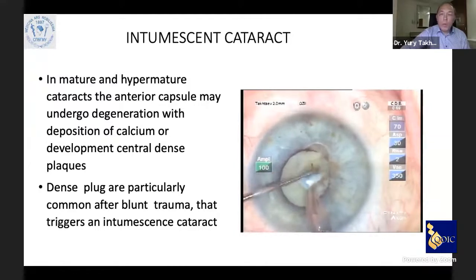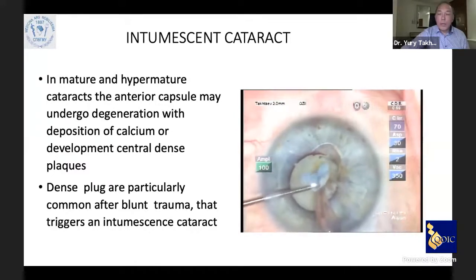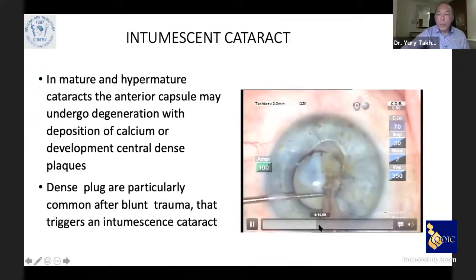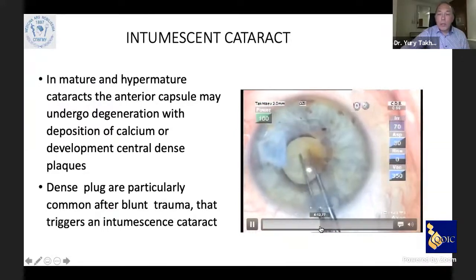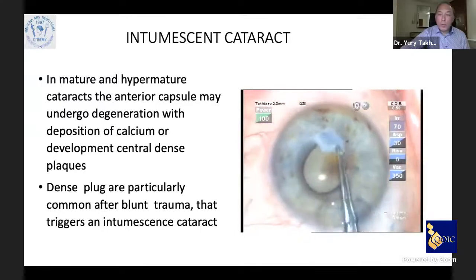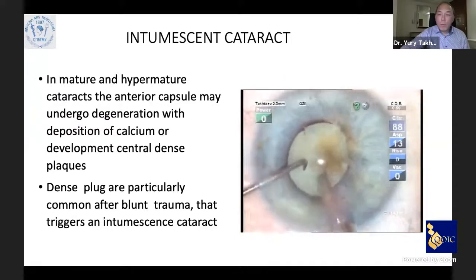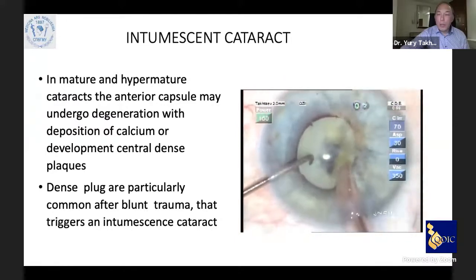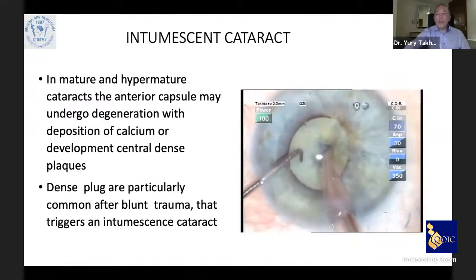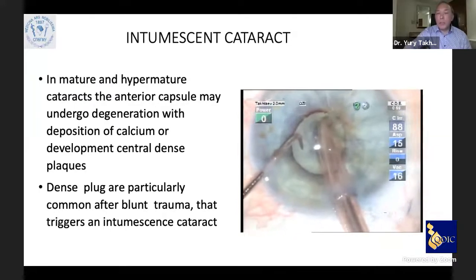We are going forward. This case is full of surprises, because the color of the lens looks like a very rock-hard, white-brown cataract. And we remove the capsule. Still we have it. We try to use the chop technique, and suddenly you can see I aspirate the central area. The color in this case does not indicate the nucleus presence, and the nucleus grade doesn't depend on the color.